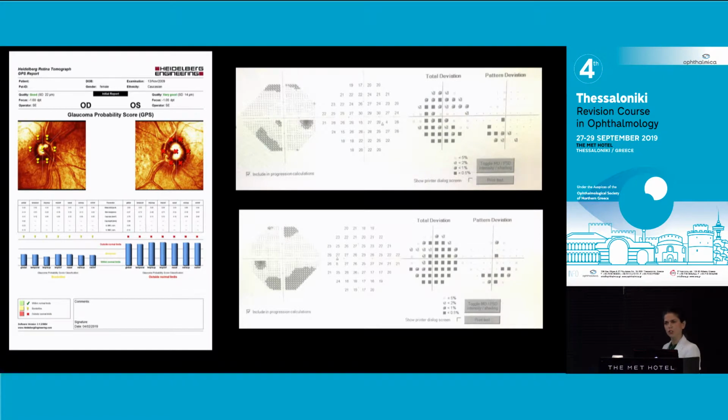And then two visual fields which are very strange. I mean, they don't really look glaucomatous. There is a missing part here. The grayscales can be very unreliable, but they give you an overview of what's happening. Do you think this could be glaucoma, knowing that the nerves look like that? Could it be? A 50% chance of having the correct answer? Yeah, maybe.